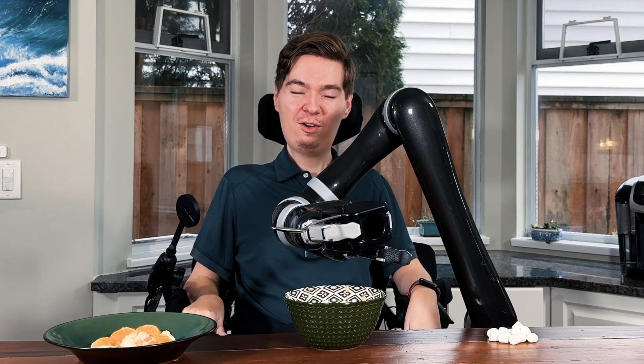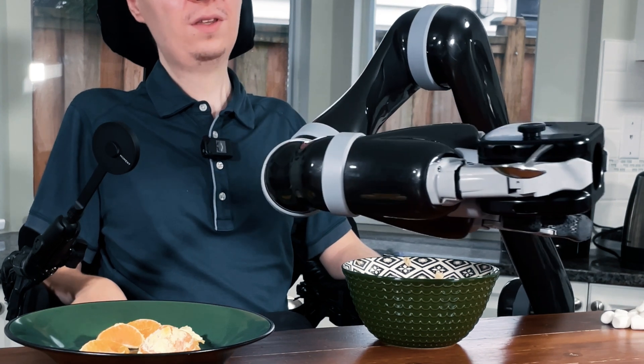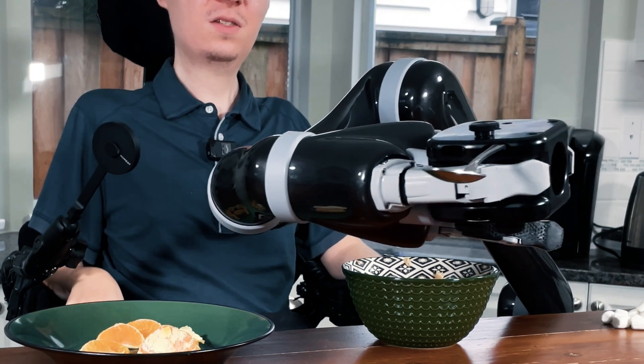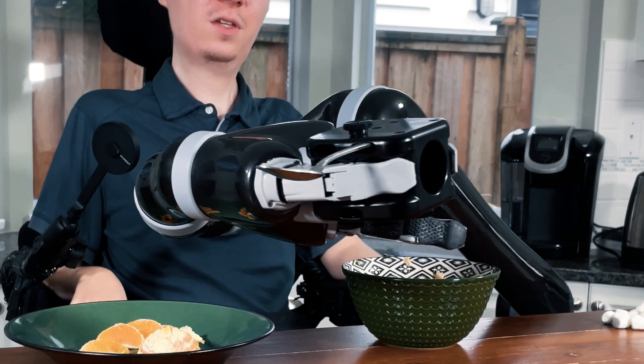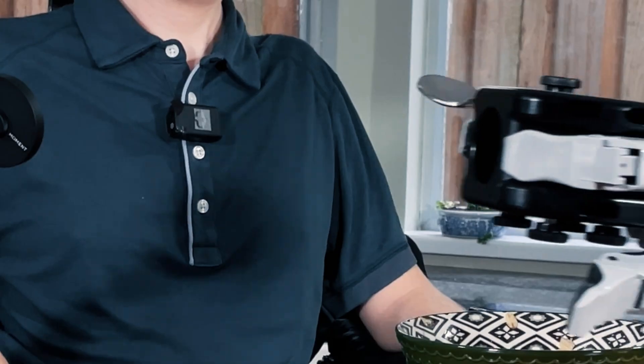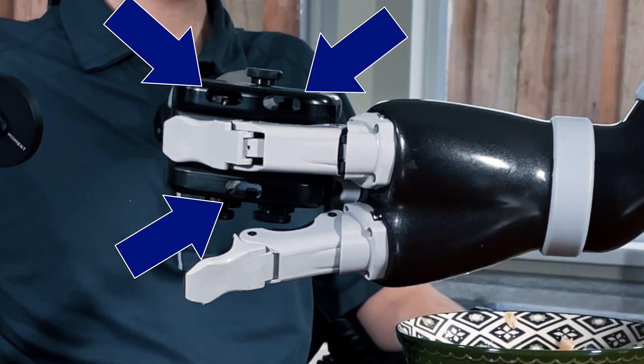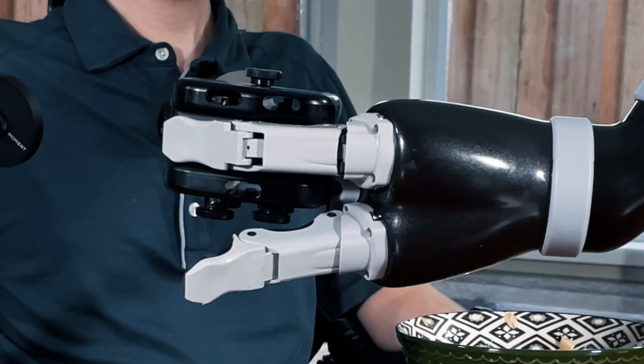For the next stop on our culinary adventure, I'd like to introduce you to the utensil holder. This is something which is going to come with each Jayco, and it is extremely versatile in what it can do. We have several holes cut into it — into those holes you slip your utensils: your forks, your spoons, even a knife if you wanted to.